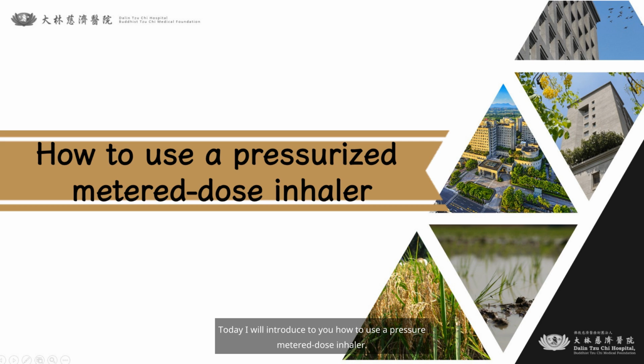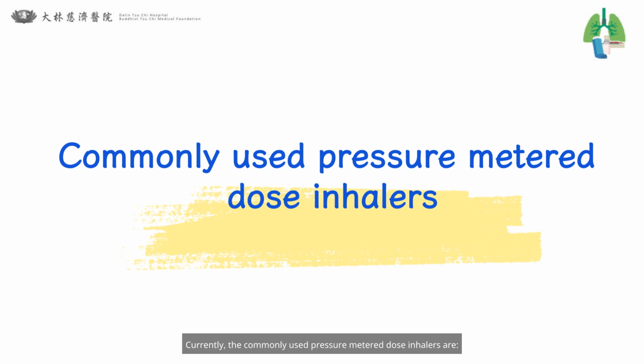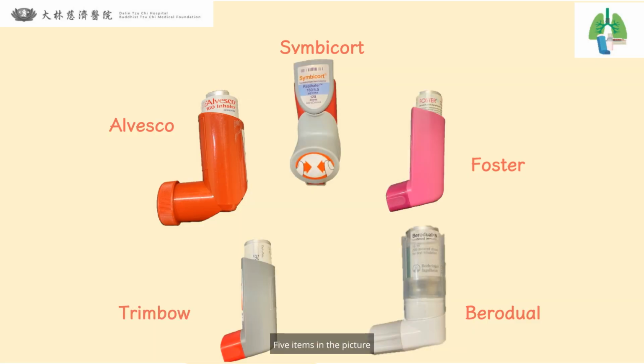Today I will introduce to you how to use a pressure-metered dose inhaler. Currently, the commonly used pressure-metered dose inhalers are the 5 items in the picture.